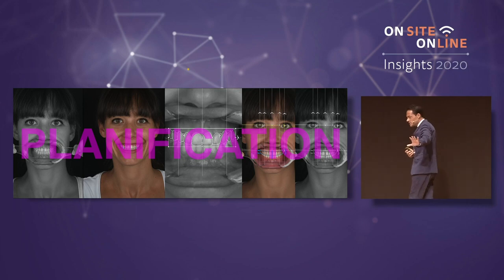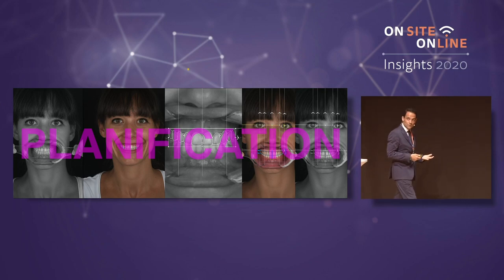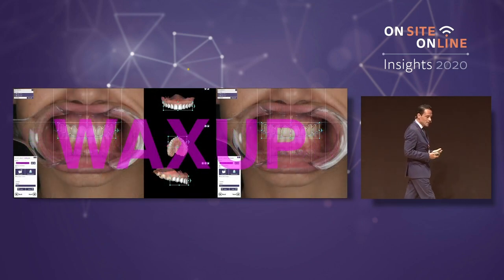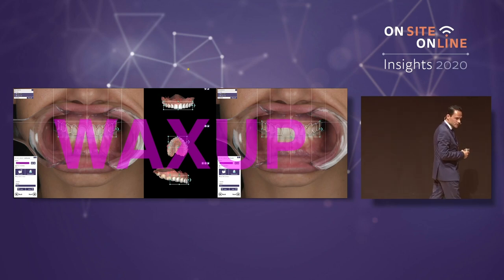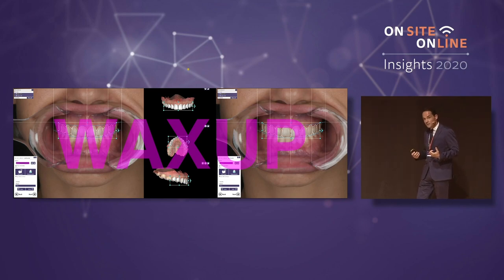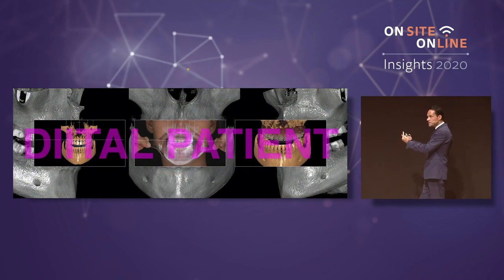If I have not this information on my screen, I'm not able to make a diagnostic wax-up. And the diagnostic wax-up, the virtual diagnostic wax-up, nowadays, thanks to all this information, is more diagnostic than the traditional one, because I'm going to use the same method that I use when I test it in the patient's mouth. I can see the result before designing it. So it is very, very important.